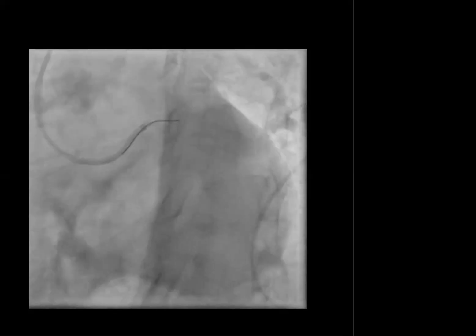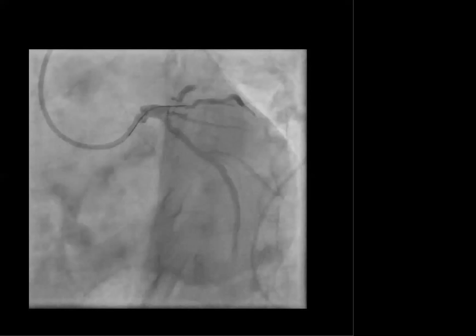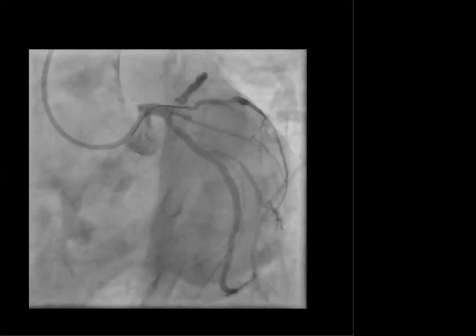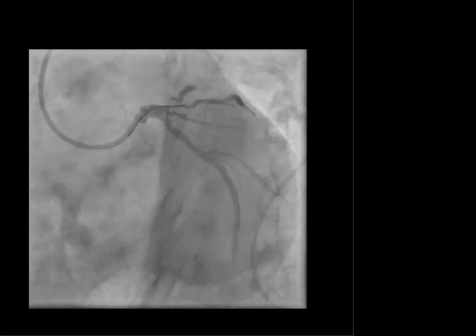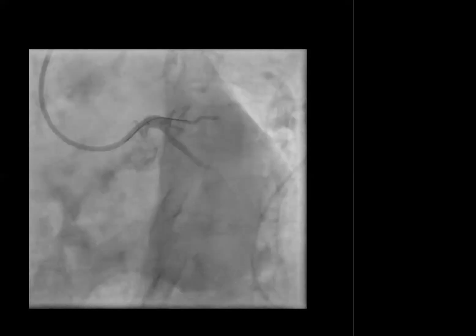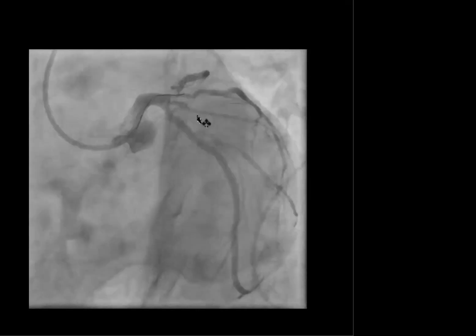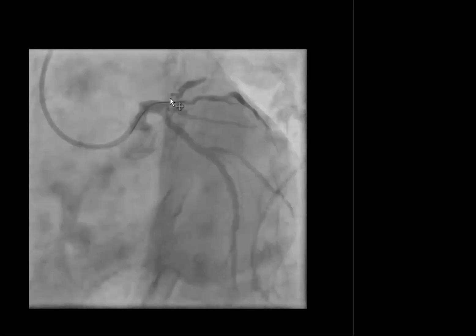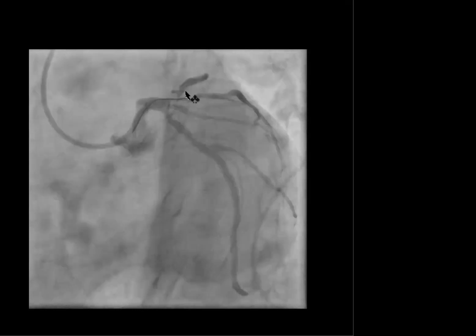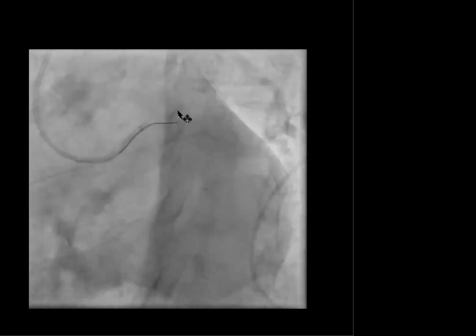Initially, the wire was going to the diagonal branch because of the angle. This is a JL4 RAD guide. We are using a 6-French JL4 RAD guide here. As you can see, this is the wire that we used. I tend to use a run-through wire or a floppy wire if I cannot see the lumen clearly, but here I can see the lumen distal to the lesion, so I'm using a Prowater wire, but it's so stiff that it is not going into the LAD.